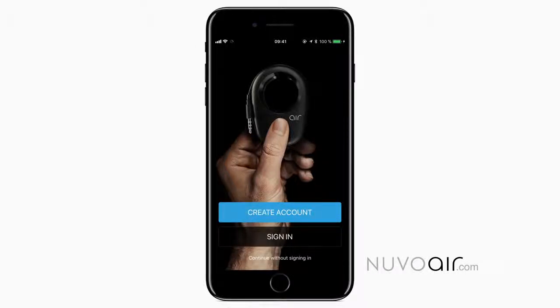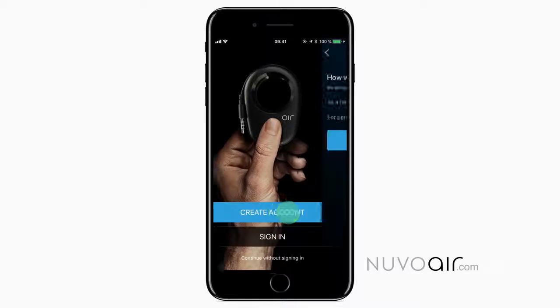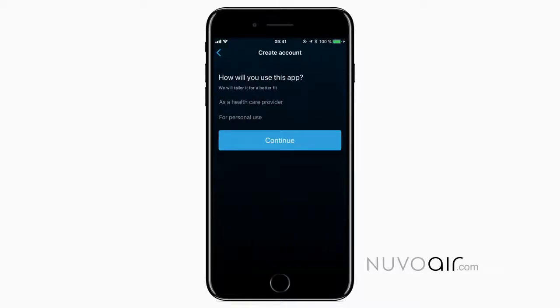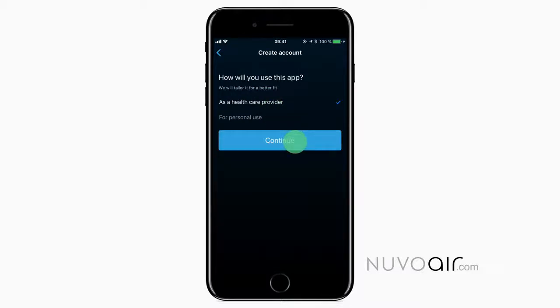Welcome to this brief demonstration of the AirSmart Spirometer app from Nouveau Air. Version 2.0 brings many improvements and is available on Android and iPhone. The first time you open the app, you are asked to create an account. Select if you will use the app as a healthcare provider or for personal use.